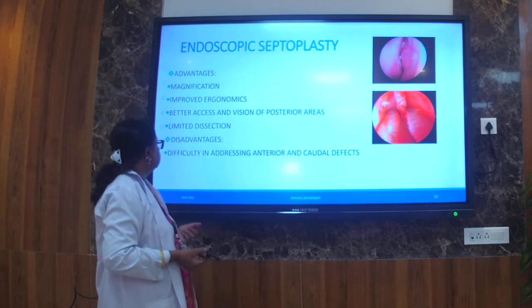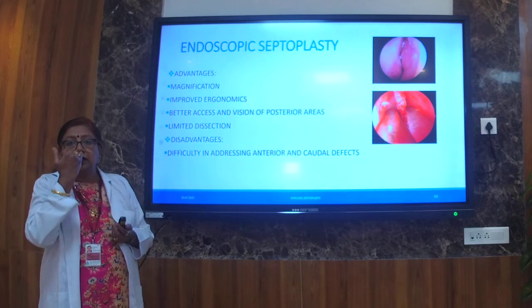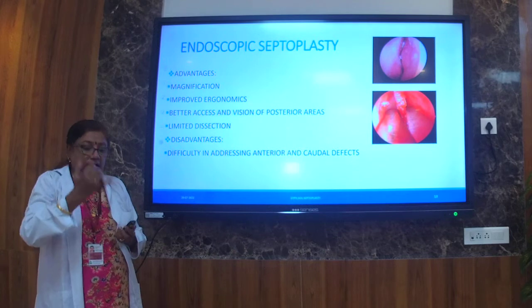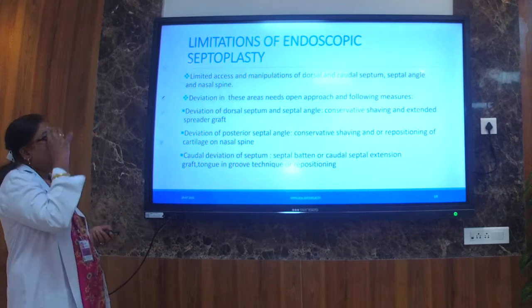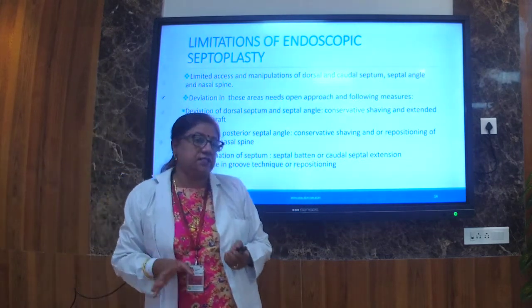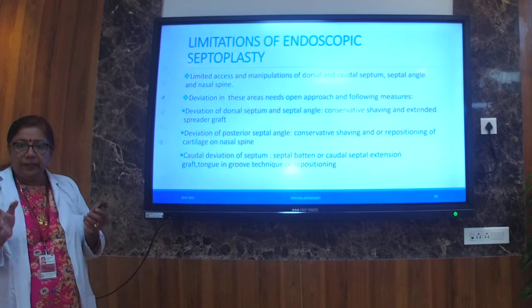So in this, addressing an anterior and caudal defect is very difficult, because the anterior dislocation is very anterior, and we find it very difficult with the scope, because the scope has to go inside, then only it will be visible. So what are the limitations of endoscopic septoplasty? Now we discuss that. So the limitations are, they are limited in access.